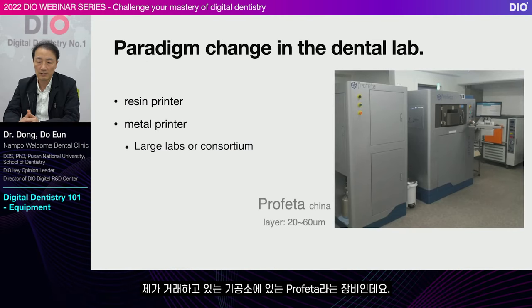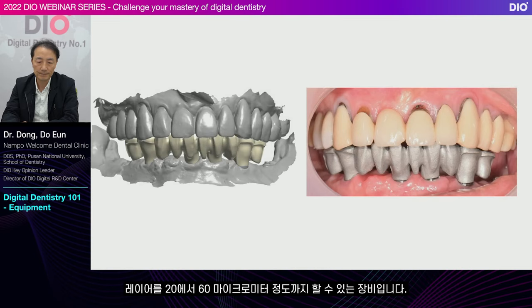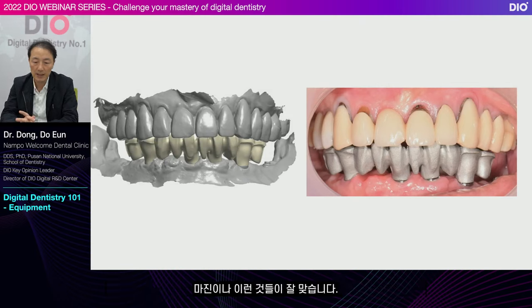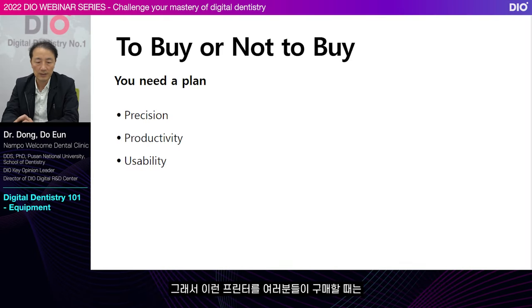This equipment is called Profeta, used by the dental lab that I work with. This equipment enables 20 to 60 micrometer layers. So I set the model made by the 3D printer into the mouth. The margins and everything fit well. Things that were difficult with the analog method a long time ago, such as a long bridge, are now possible.